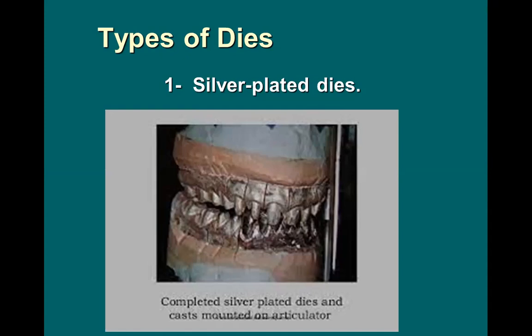The technique of producing the silver plated dies is a slightly complicated technique, but it has the advantage of a hard die which will not be distorted or fractured during the next procedures or next steps of doing the casting and waxing and so on.